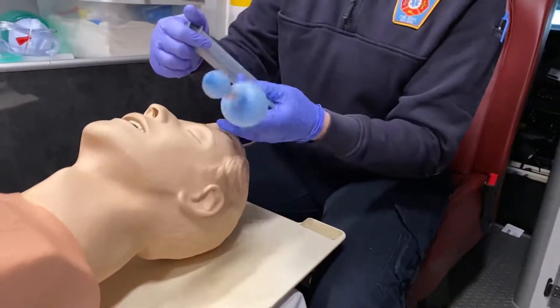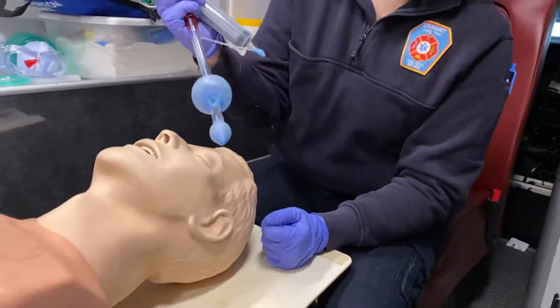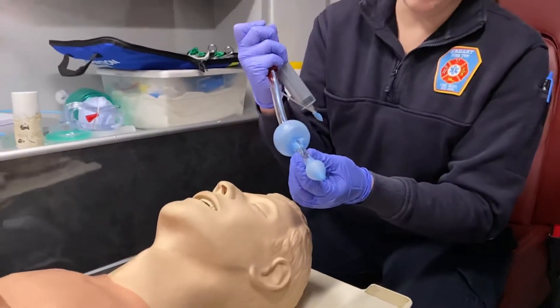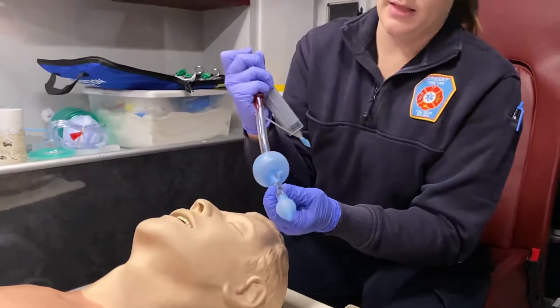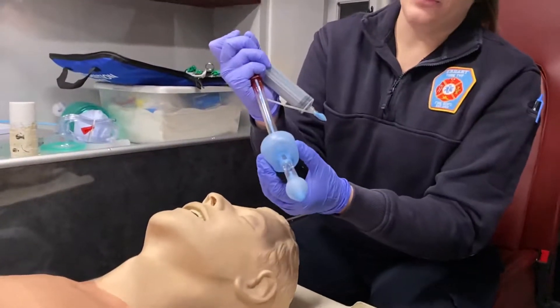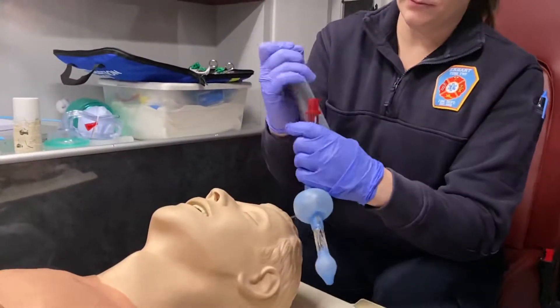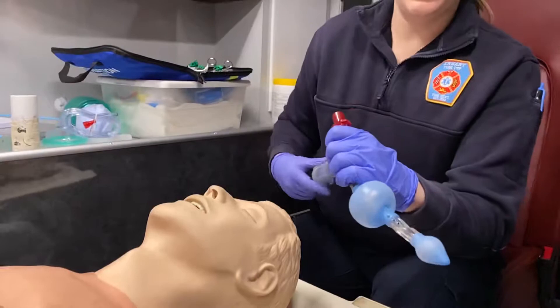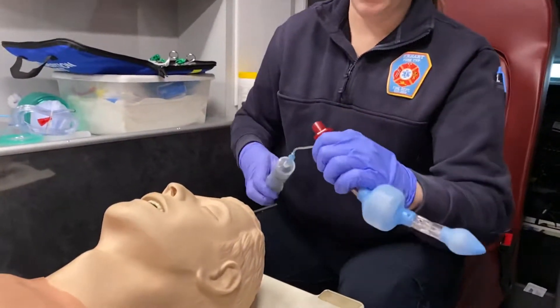The way this King works is it's a blind insertion, and it's actually made to go into the esophagus. Once it's seated in the right place, this balloon will inflate to close off the esophagus, and this port will then force air down the trachea. This balloon here closes off the oral pharynx so we don't get any air leaking around it. Some of these also have a port for oral gastric suctioning — this one, however, does not.